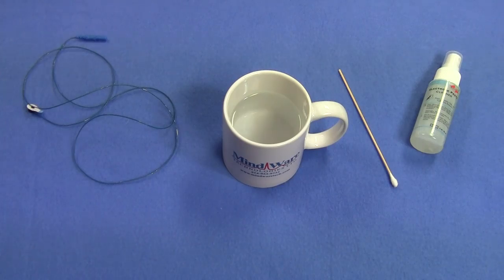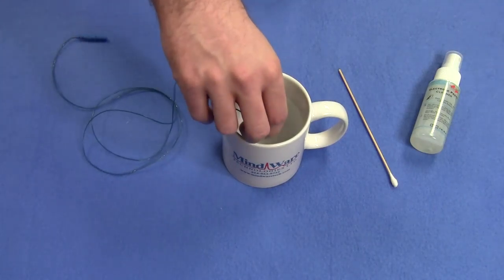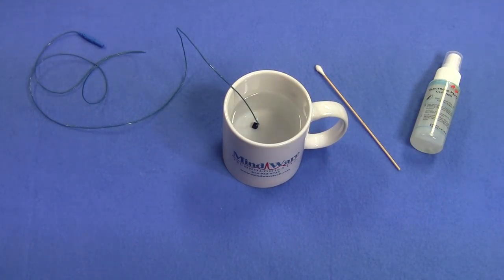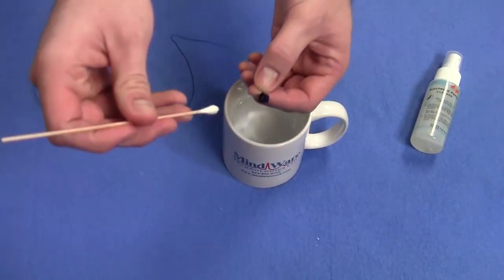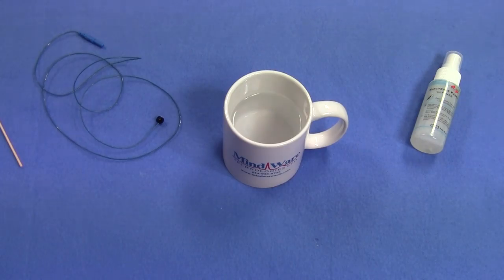EMG electrodes should immediately be washed with soap and water after each use, as the electrolyte gel used during EMG collection is water soluble. Cleaning the electrodes with alcohol will result in smearing, which can build up within the electrode and speed up corrosion. We recommend keeping a container of tap or distilled water in the lab. After each experiment, soak the electrode in a cup of water for up to 90 minutes. Following the soak, wash the electrodes with a liquid dish soap or electrode cleaning spray — a cotton tip applicator can be used to scrub the inside of the cap. After the electrodes have been thoroughly cleaned, place them out to dry. It's important that the electrodes are completely dry before the next experiment.